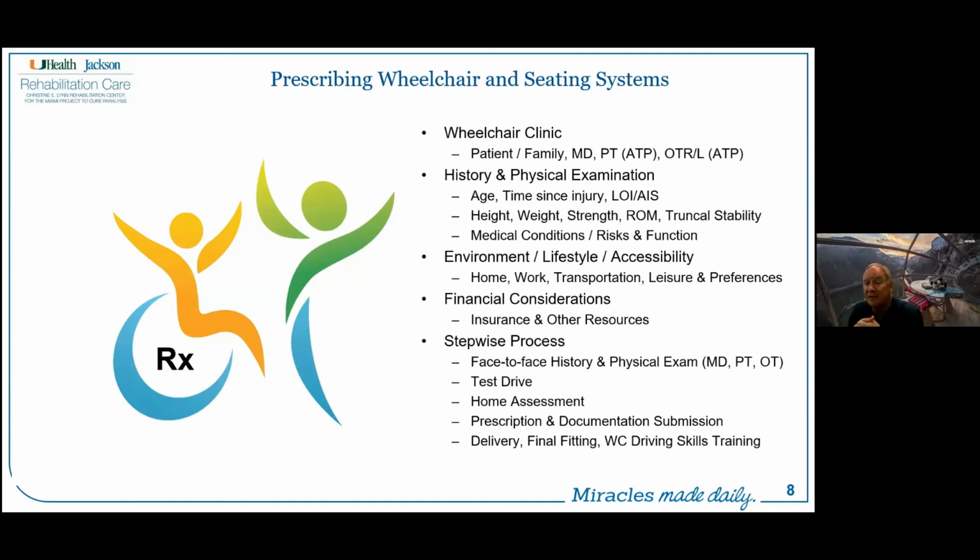So a wheelchair clinic may be a couple of different clinics. It's rare that you can do all of this in just one clinic visit. So having the patient, the family, or the client and the family there is going to be important. The physician is ultimately going to have to sign the script. The PT and/or OT, and ideally these are folks who have assistive technology professional certification. All of these are going to be contributing to the prescriptions for the wheelchair and the seating system.